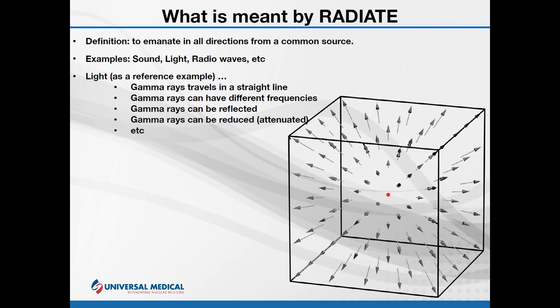Because of the penetrating power of the gamma ray, there is no real effective way to lens them. Light, you can focus it with a lens, with a magnifying lens. I can focus light. Can't do that with gamma rays. They just blow right through things like that. If you can come up with an effective and efficient way of lensing gamma rays, let me know, and we'll patent it together, and we'll both make a lot of money.